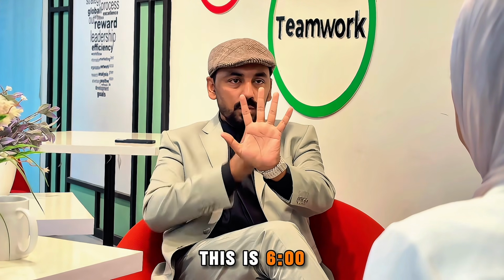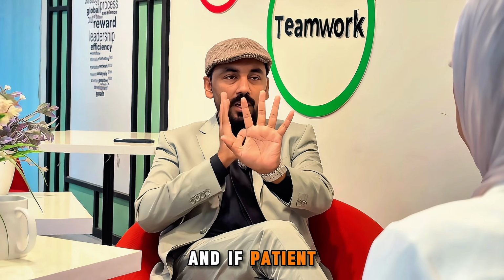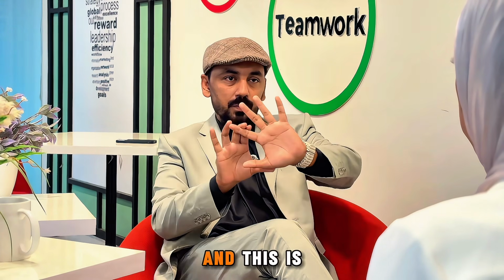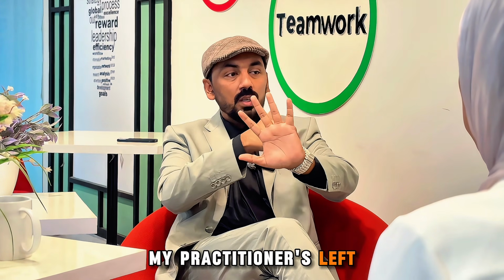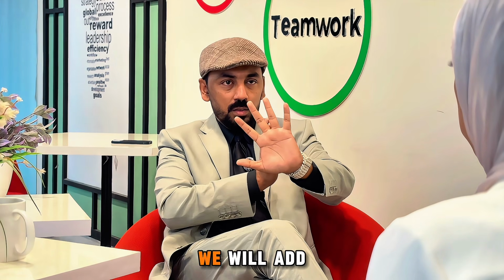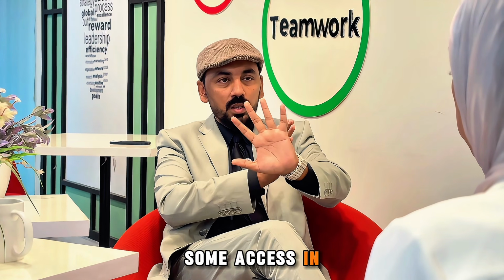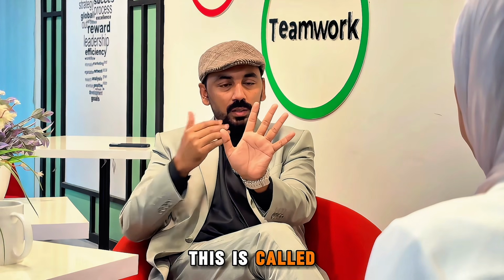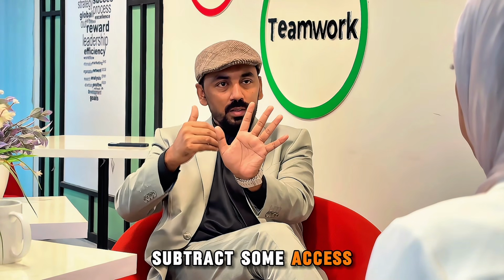So for example, this is the appropriate 6 o'clock position. And if the patient blinks and, with the blinking, the lens rotates towards this side, which is my, the practitioner's, left side, this rotation is called left side rotation or clockwise rotation. In this case, we will add some axis to the spectacles axis. And if the contact lens is moving towards the right side of the practitioner, this is called anti-clockwise rotation, so we will subtract some axis from the spectacles axis.